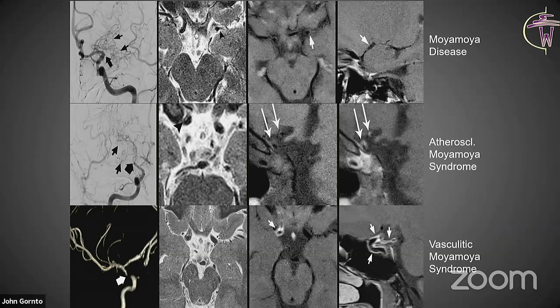And similarly, we can see the T2 hyperintense band and that wall thickening involving atherosclerosis, nothing on Moyamoya disease, and iso-intense wall thickening on the inflammatory vasculopathy case.